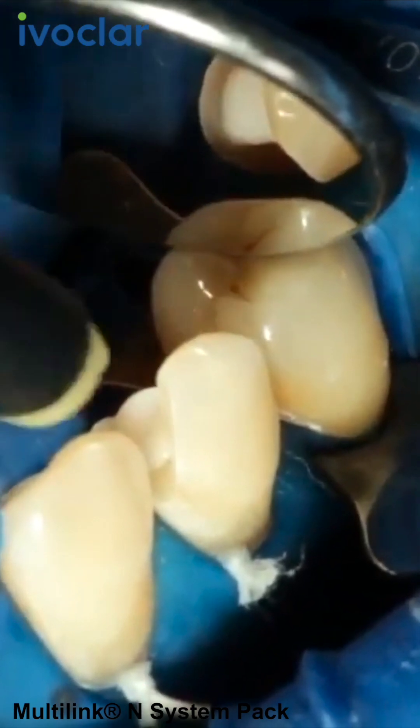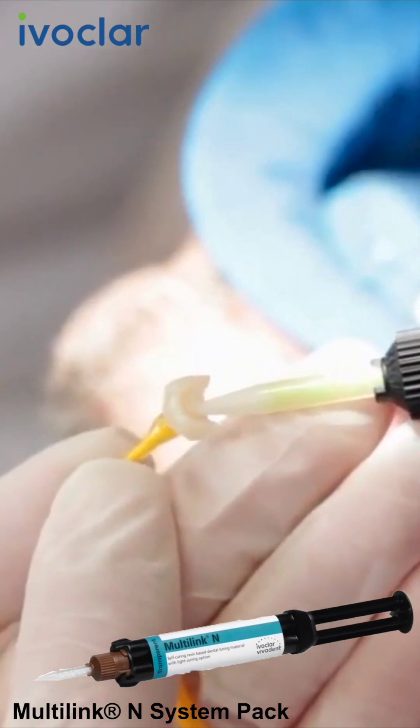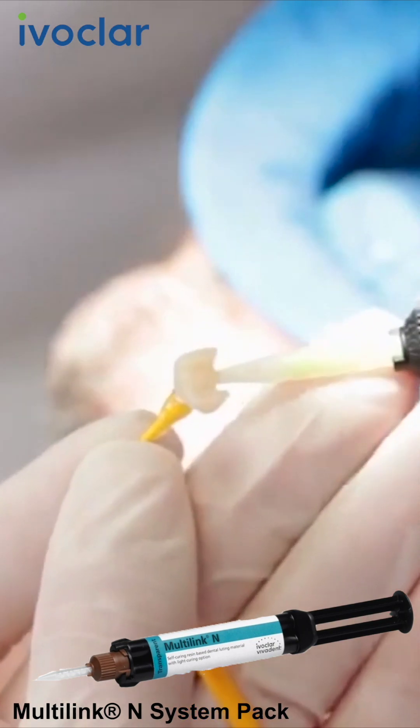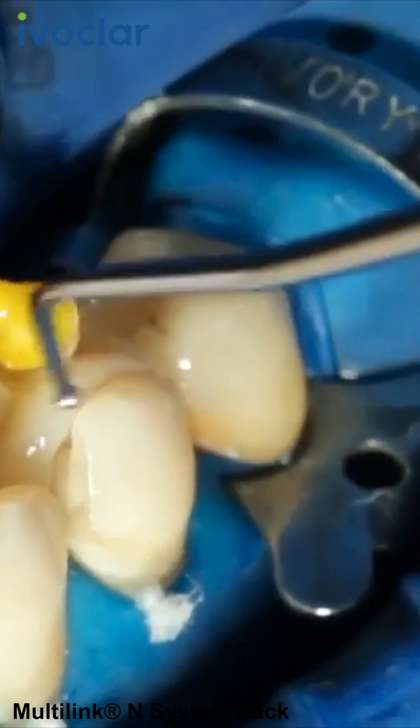Dispense the desired amount of Multilink N from the auto-mix syringe and apply it directly to the restoration. Seat the restoration and hold it in place using light constant pressure.